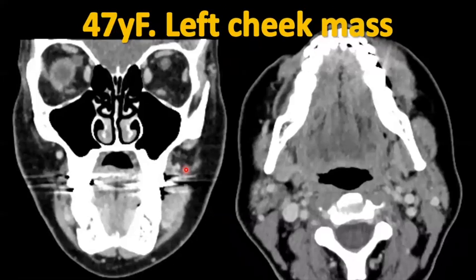This is another patient, presenting with a left cheek mass, and you can see the asymmetry quite readily when you compare it here to the normal side. In this case, you can see the buccinator muscle, which will insert on the orbicularis oris muscles, but you can see here this marked fullness, and without a distended cheek, people get a little confused sometimes in understanding exactly where this is.